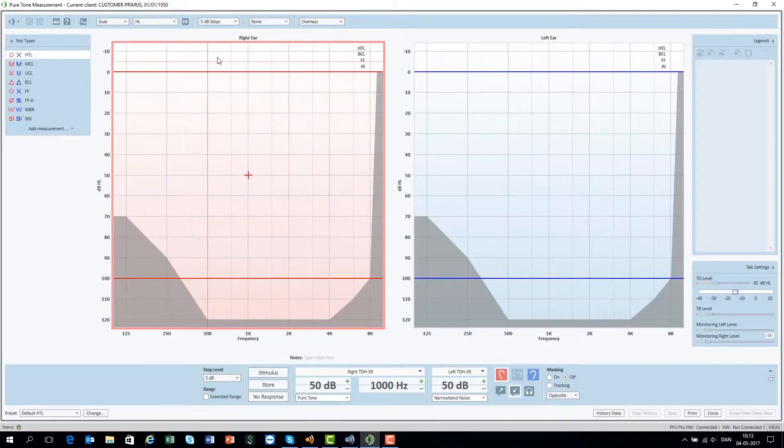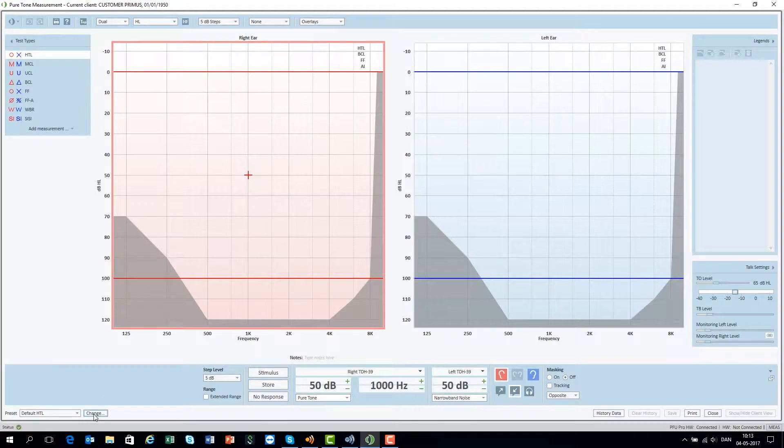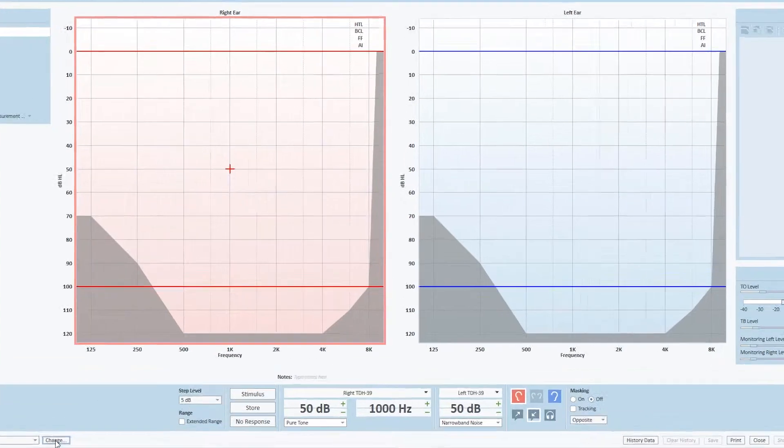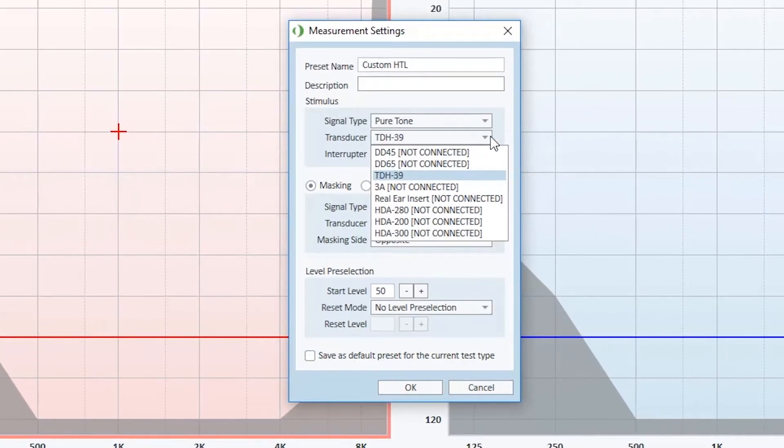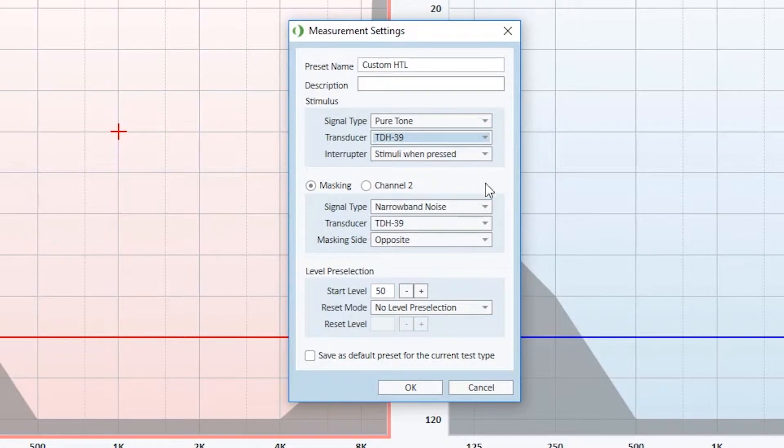Primus provides predefined editable settings such as how to change the signal type, what transducer to use and how stimuli are presented.